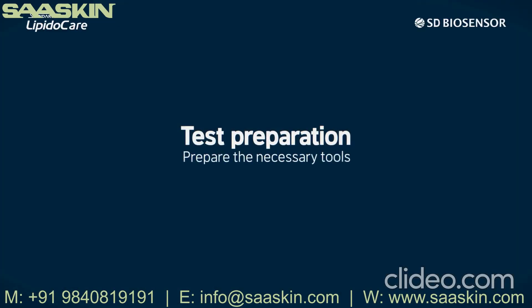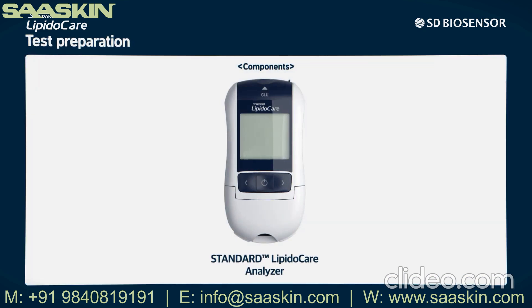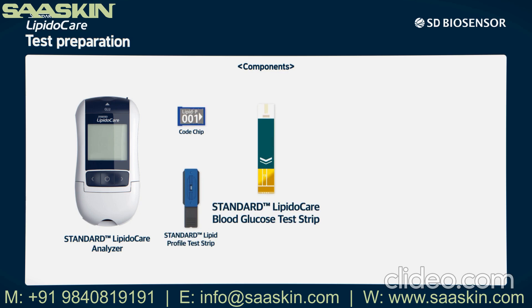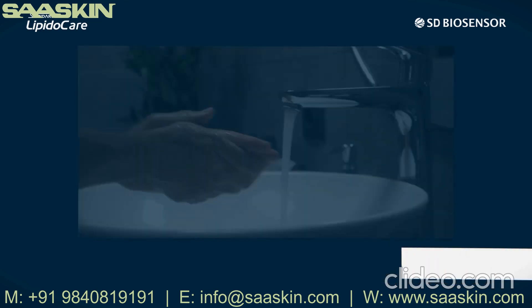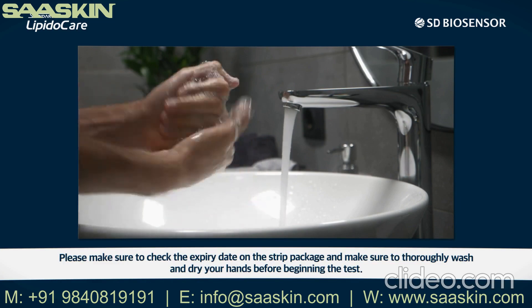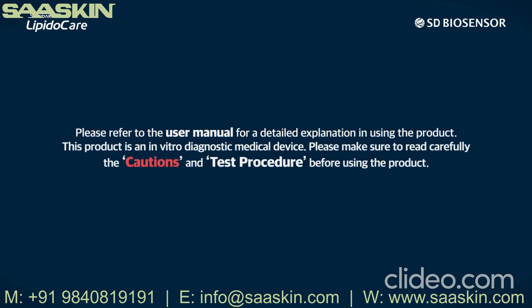Test preparation — prepare the necessary tools for the test. We need the Standard LipidoCare analyzer, code chip, Standard Lipid Profile Test Strip, Standard LipidoCare Blood Glucose Test Strip, Standard Easy Tube Plus, Standard Safety Lancet, and Standard Alcohol Swab. Please make sure to check the expiry date on the strip package and thoroughly wash and dry your hands before beginning the test. Please refer to the user manual for a detailed explanation. This product is an in vitro diagnostic medical device — read the cautions and test procedure carefully before use.